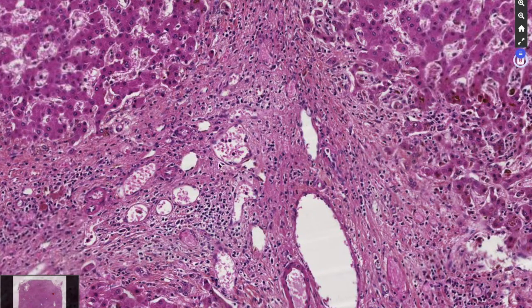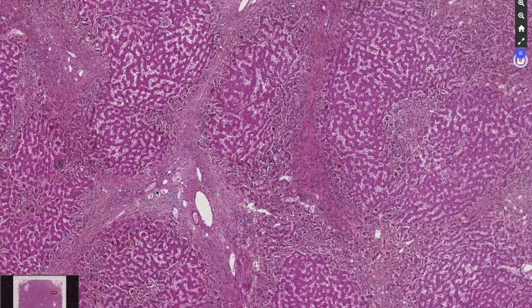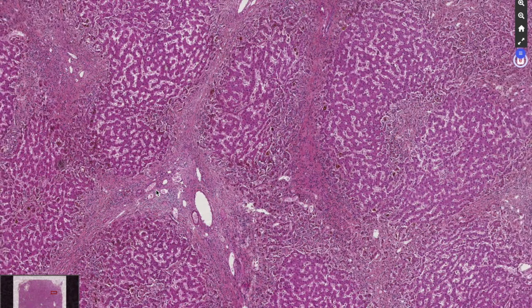the artery, the vein, and so far the appearance is not really specific, but what is important is not what is on the slide, it is what is not on the slide, because I don't know if you noticed, but we never saw a bile duct. And we have to see sometimes in the fibrotic bands some bile ducts, because in the fibrotic bands there used to be portal tracts.